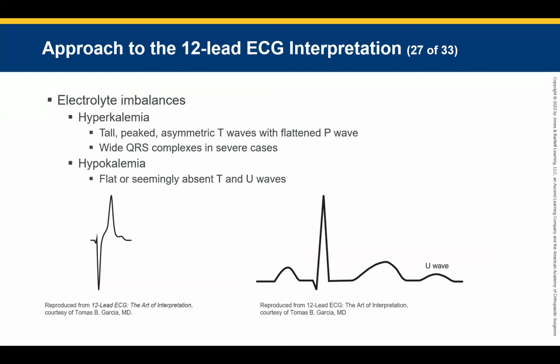Pericarditis, sick patient, needs antibiotics. You may or may not be able to start that treatment based on the patient in your department. Hyperkalemia, sick patient, needs fluids and maybe dialysis, depending on the cause. We can give fluids, we can't give dialysis, but we can take them to a hospital that can. Paced rhythms, now that might be normal. What else is going on with them? I wasn't saying just ignore it. I'm saying it means it probably isn't a STEMI. If you see this and what looks like a STEMI, it's probably not a STEMI.